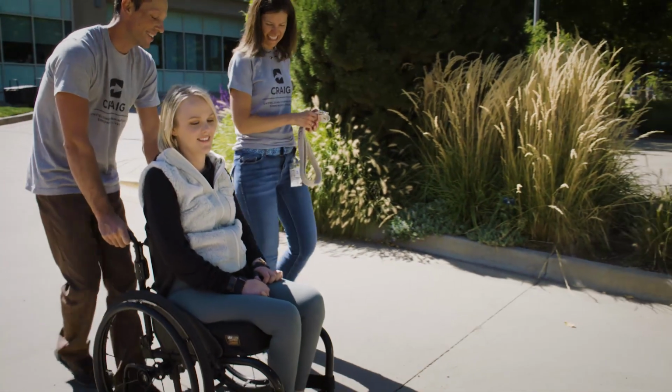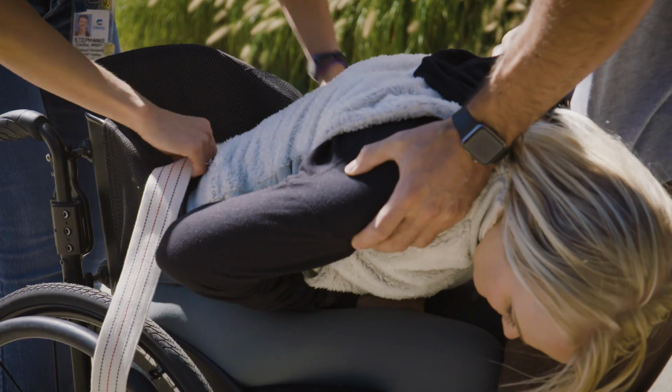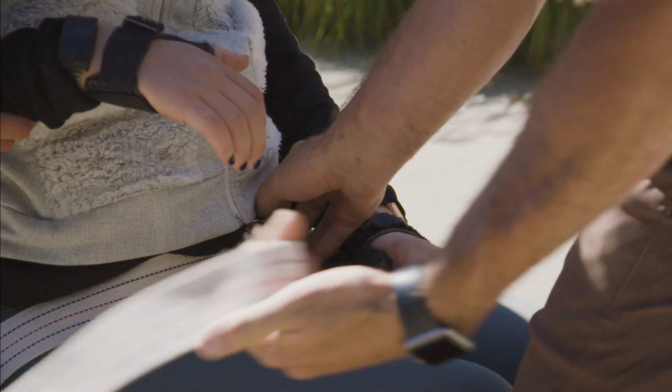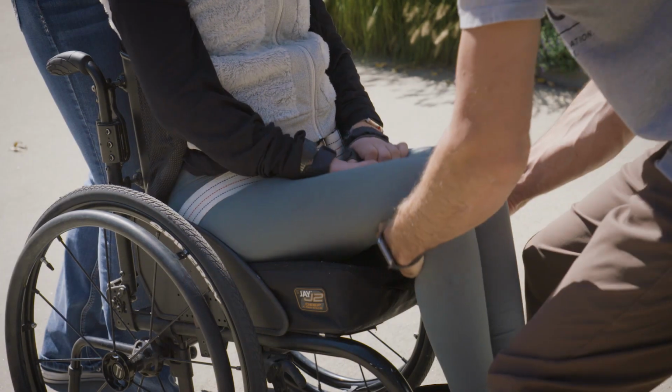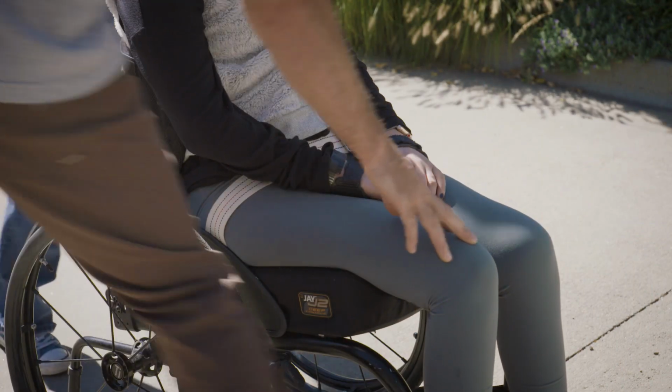When preparing the passenger for transfer, lock the brakes and place a lap belt low and snug over the hips and pelvis. Move the hips forward to ensure the passenger clears the wheelchair tire when they transfer.